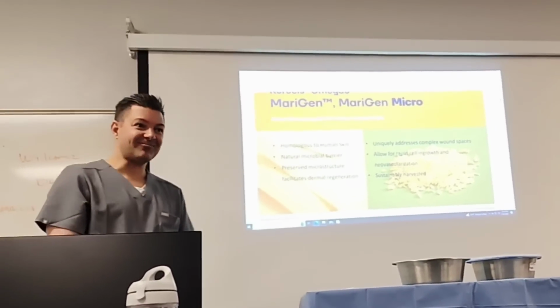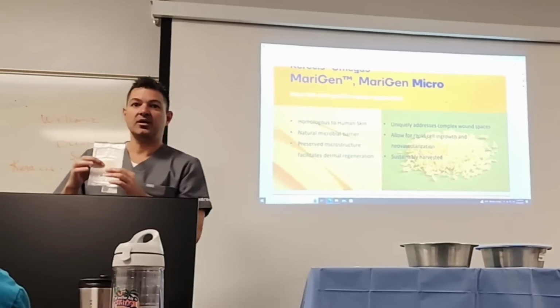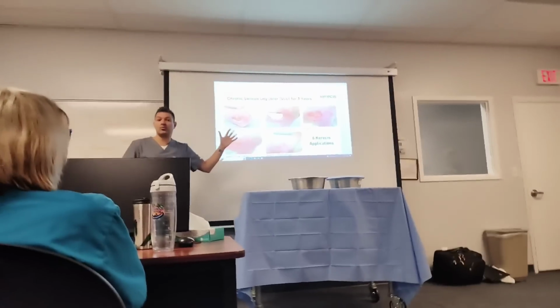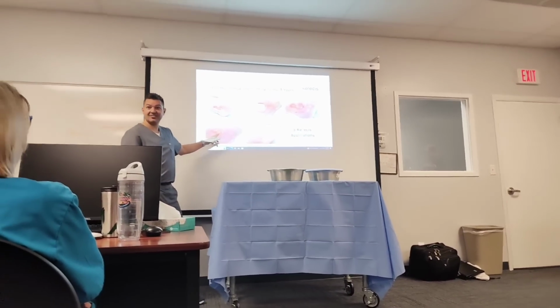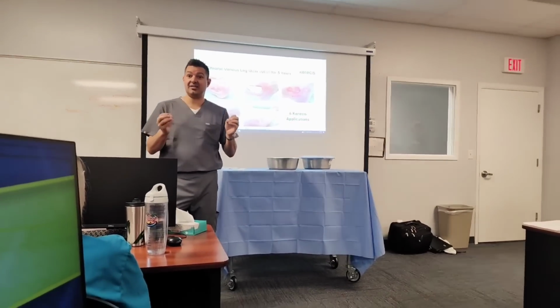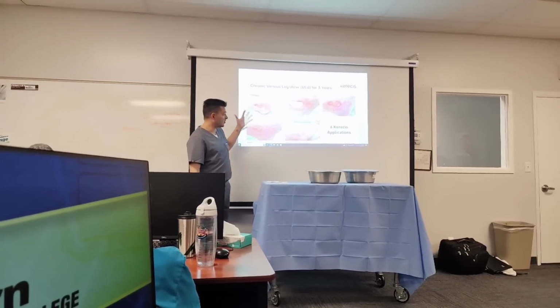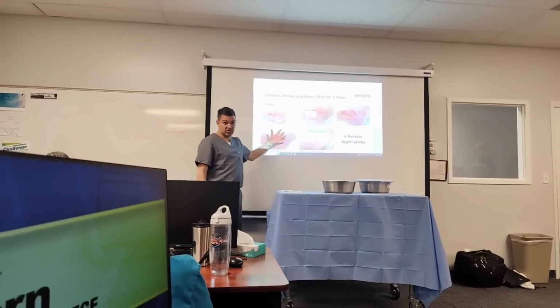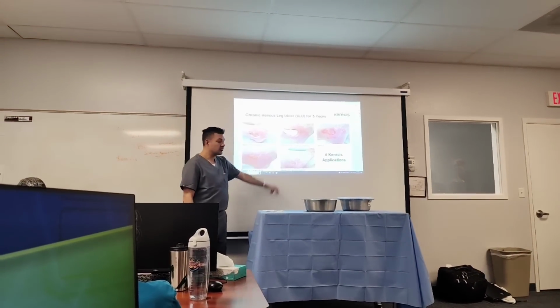Good question. Okay, again, I talked a little bit about the micro. The micro is really great. We're applying it all over, for crevices and some of the tunneling aspects, which are really tough, because there's not a lot of vascularization in the ankle area. So what do you do in these types of situations? Again, what did I say our premise was? You want to make it bleed to seed, right? So we really have to do a great job of debridement in these areas so we can create the bleeding to have the healing. These are really, really challenging areas to heal. But with Kerecis and reapplications, we can have great success with them.